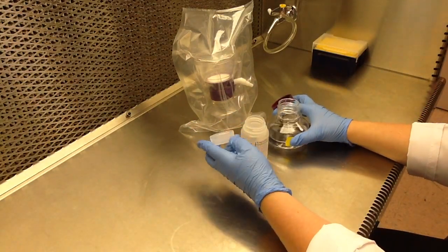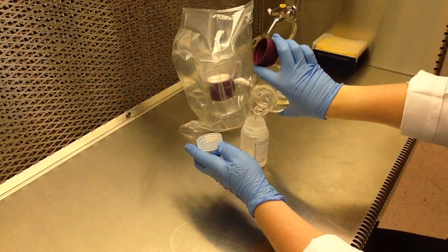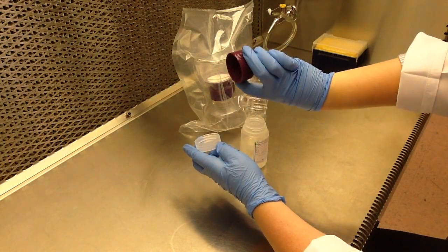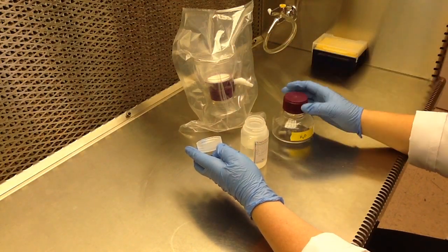So first, I'll be adding the volume of double distilled water that's necessary to the bottle. Here, I had it pre-measured according to the instructions on the front side of the bottle.